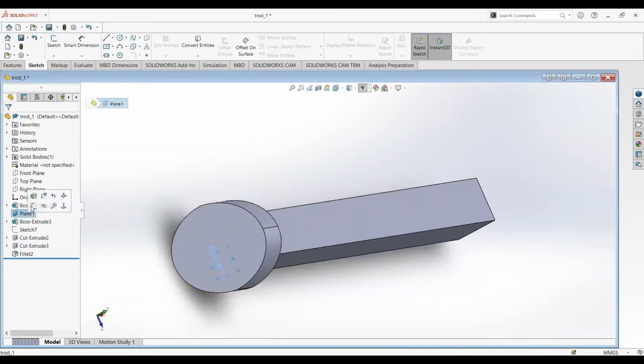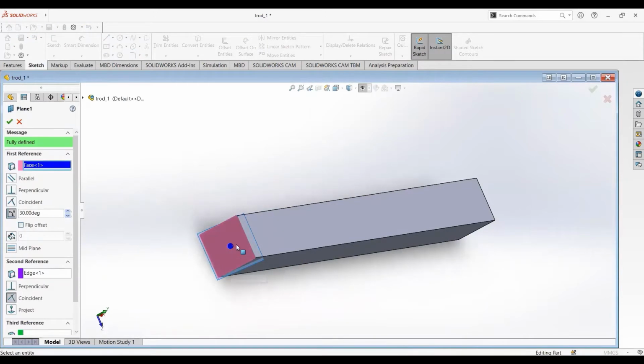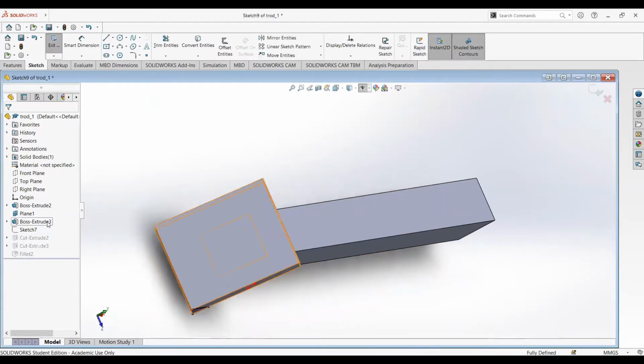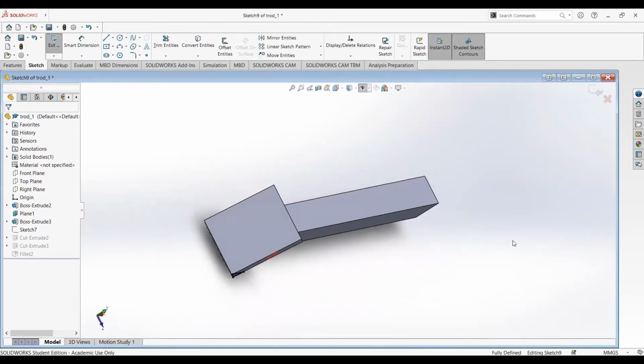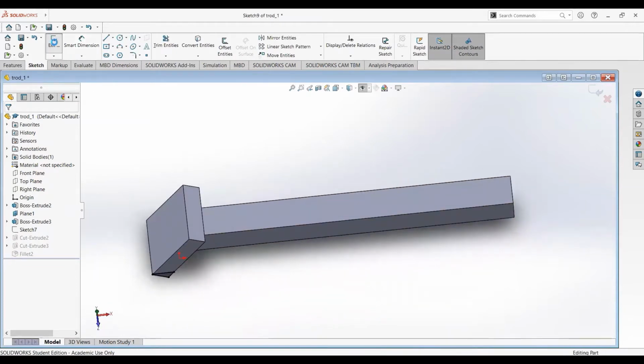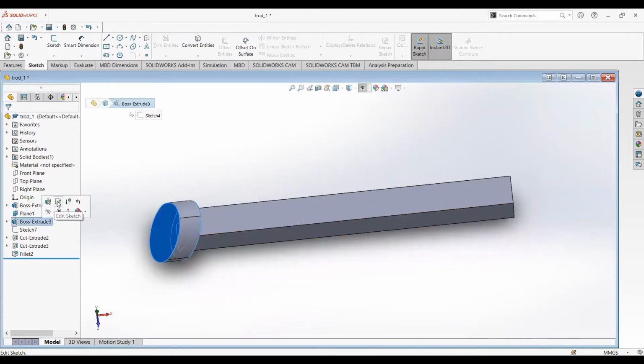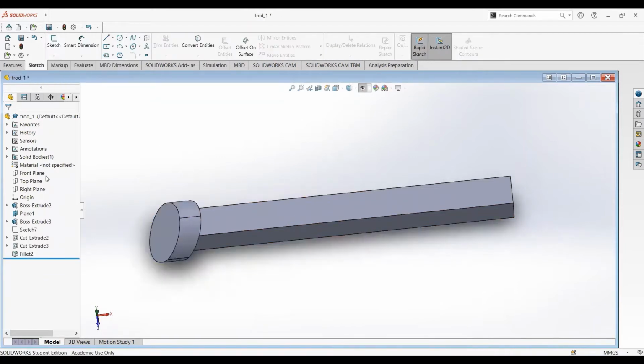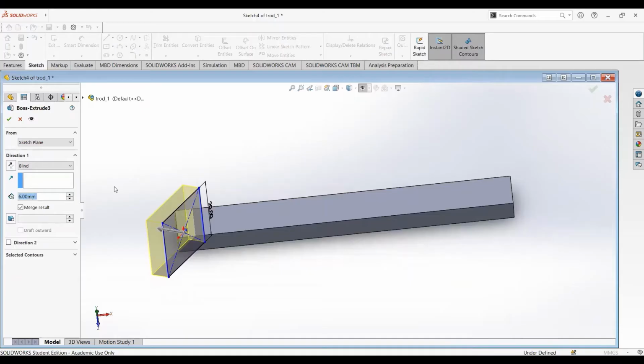After that, we made a reference plane, this pink area, so we can sketch on this part. And as you can see, I think I skipped. Okay, as you can see, we created this. And then we extruded that as well. We extruded by 6 millimeter right here.